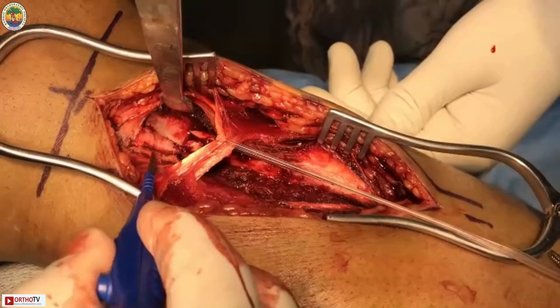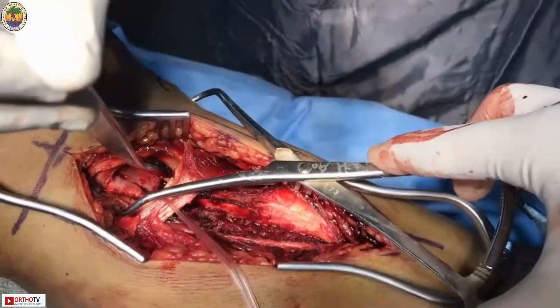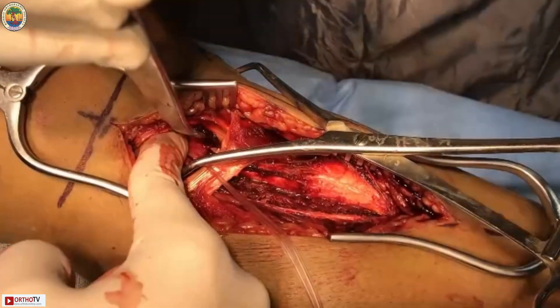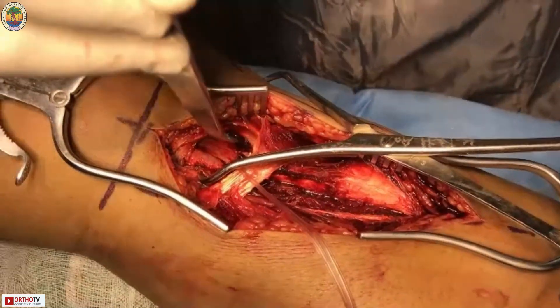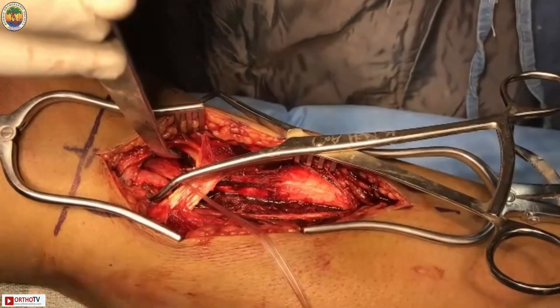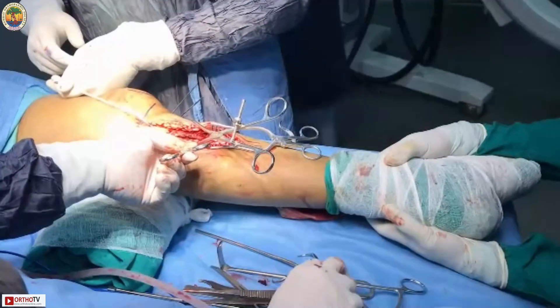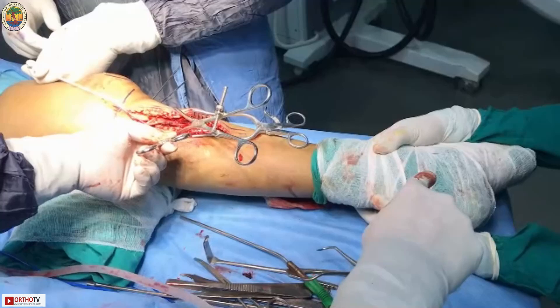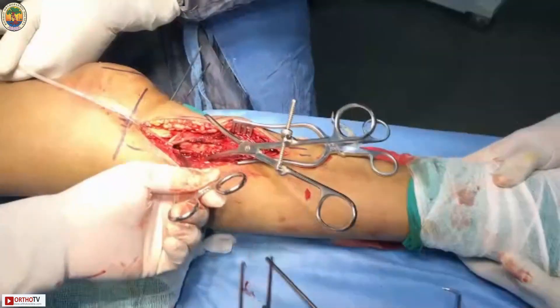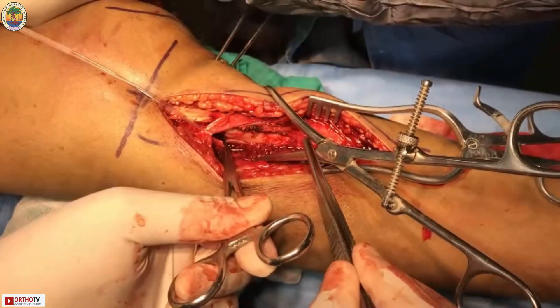The fragment is first fixed with a K-wire. The sagittal split is temporarily fixed with a towel clip, ensuring no step and adequate compression at the fracture site. A 2.5mm K-wire is used, which can be converted afterwards to a 4mm cannulated cancellous screw.